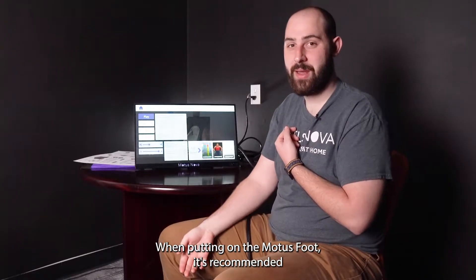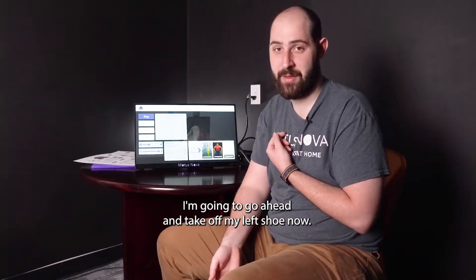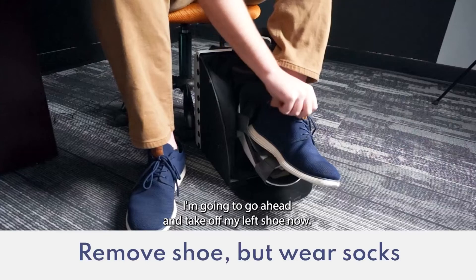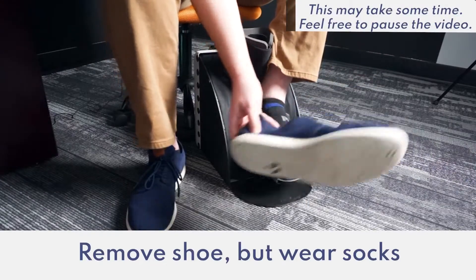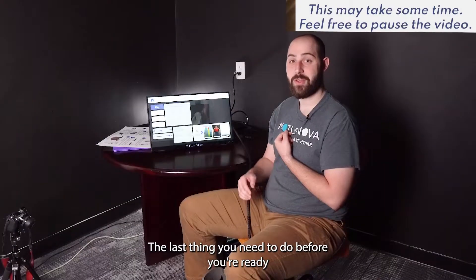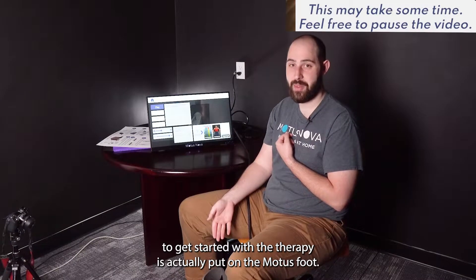When putting on the Motus Foot, it's recommended you do this either barefooted or with a sock on. I'm going to go ahead and take off my left shoe now. The last thing you need to do before you're ready to get started with your therapy is actually put on the Motus Foot.